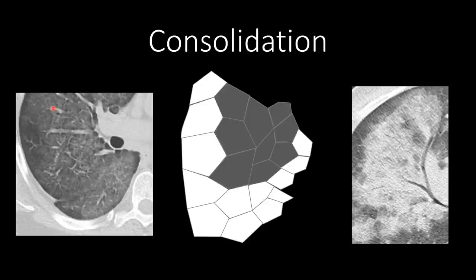Ground glass opacity compared to consolidation: notice you can see the vessels within the ground glass opacities and there are no air bronchograms, which distinguishes it from consolidation.